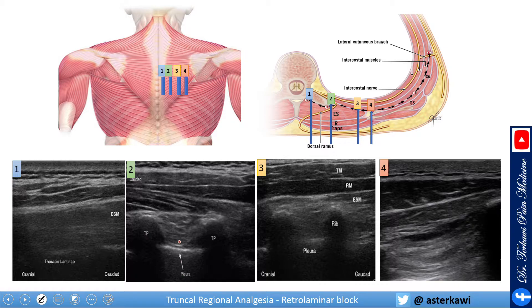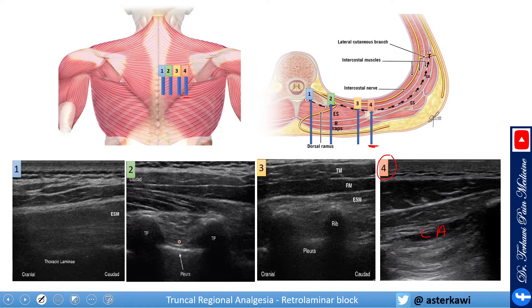I want you to pause this video and think about these numbers 1, 2, 3, and 4. I have put some ultrasound pictures here and I want you to think about what block can be done at positions 4, 3, 2, and 1. Number 4: the ultrasound probe is placed here — this is a rhomboid intercostal plane block with local anesthetic. Then you go more medial to number 3, and now you are seeing ribs, so what you can do here is an intercostal nerve block.